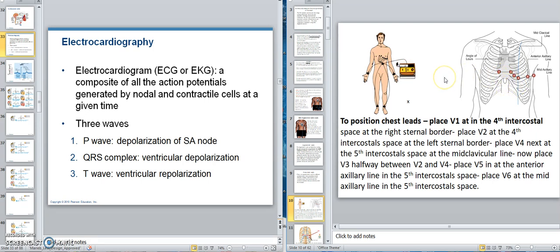So you're putting these electrodes on, and these electrodes form the leads. Now, the leads and electrodes are two different things. The electrodes come together, several of them, to form a lead. You will have some leads on the arms and the legs and some on the chest. Those that have had an EKG, I'm sure, are familiar with that. Okay, so you're attempting to get a look at this.